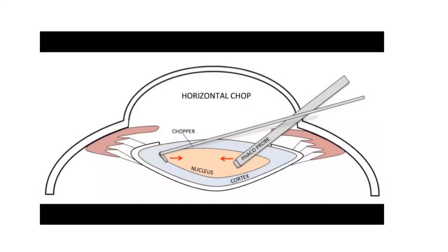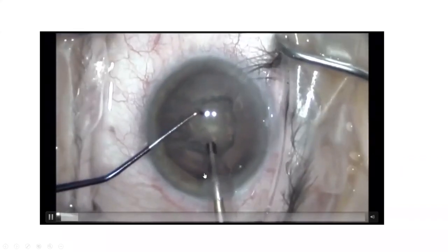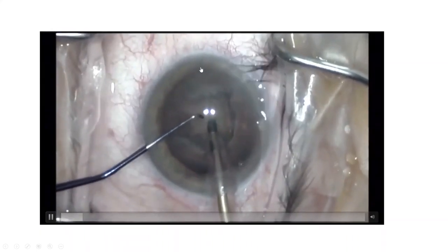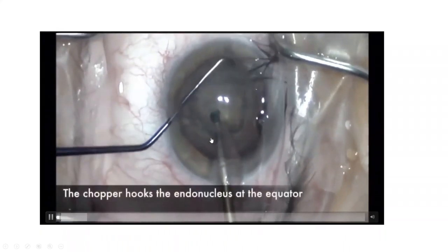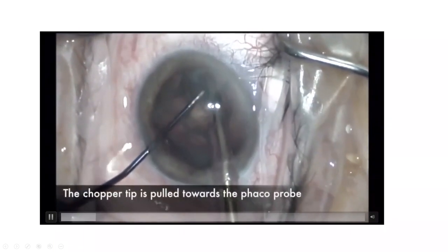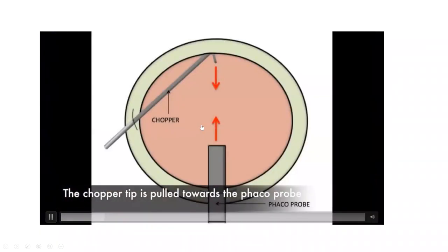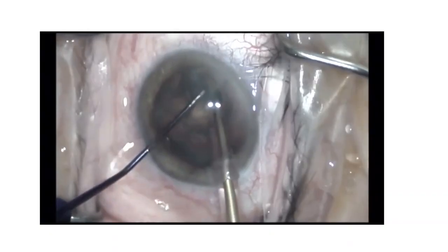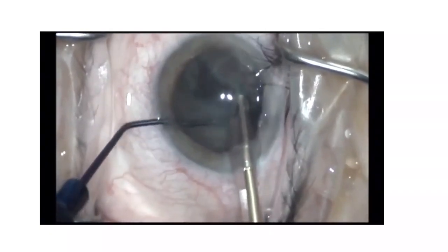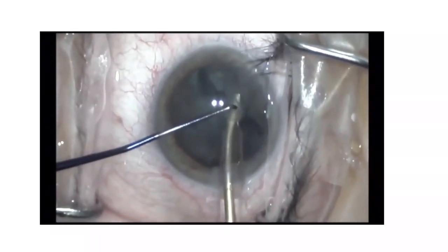Okay, so let me show you here the difference between the horizontal and vertical chop. Here the horizontal chopper is going toward the equator of the lens in order to divide the lens. So its movement is a horizontal movement. You see, the chopper will hook the endonucleus at the equator and then move in a horizontal direction. Then by lateral separation between the phaco tip and the chopper, the nucleus will be cracked. So you just bring it from the equator to the center, and then lateral movement between the phaco tip and the chopper results in cracking of the nucleus.